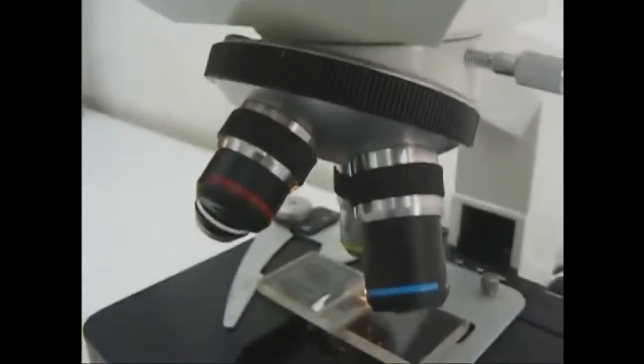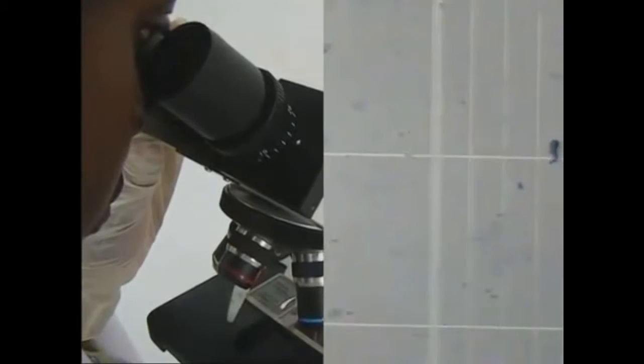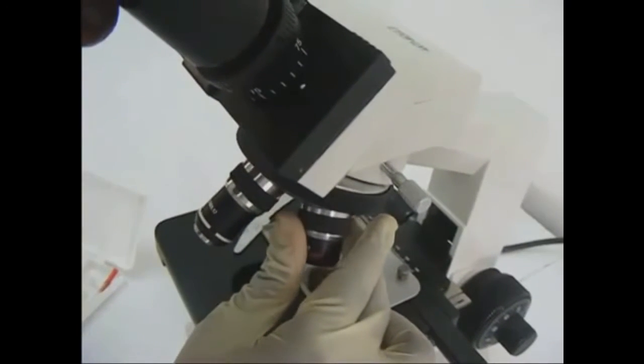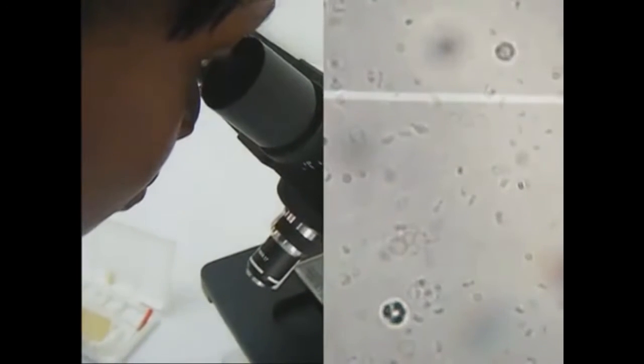At the objective magnification of 10, the white cell counting area is seen prominently with tiny white blood cells. At the objective magnification of 40, the white blood cells are very visible and suitable for counting.